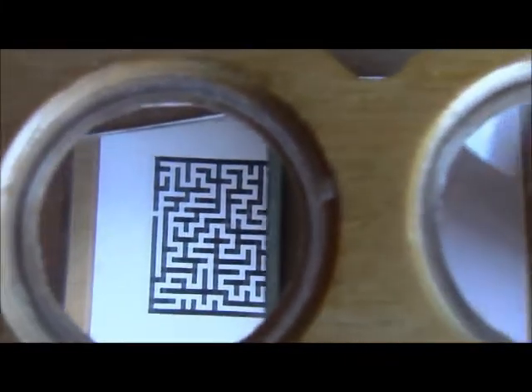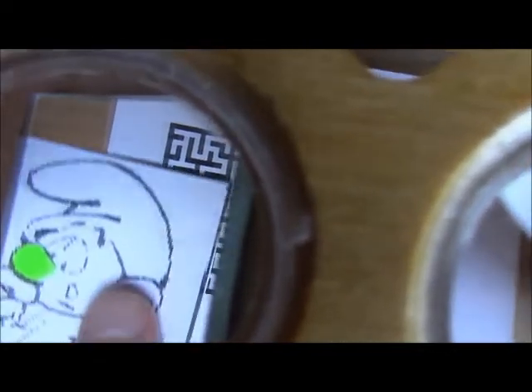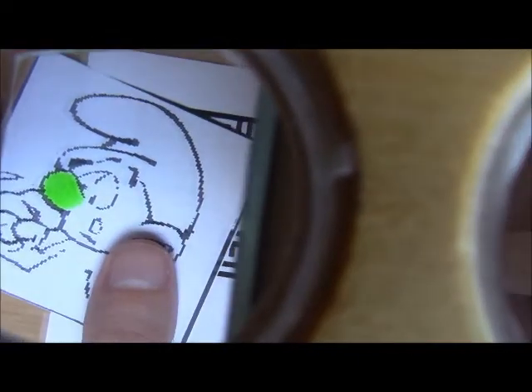So one eye would be fed a maze or whatever image you would like to show it. An easier version would be an image like a Smurf, and the other eye would be seeing a blank sheet of paper.